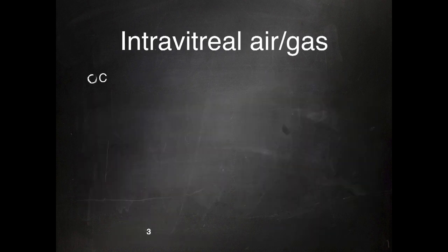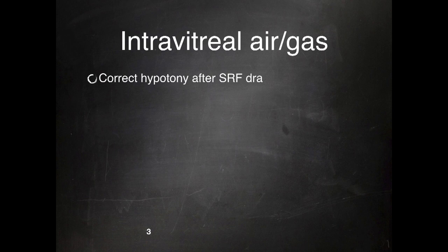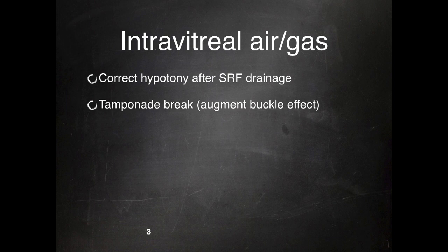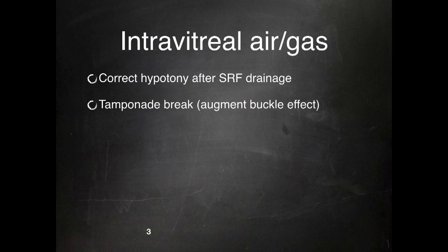It's important, if you're considering drainage, to have intravitreal air or gas ready to correct the hypotony after subretinal fluid drainage. The use of air or gas could also have a tamponade effect, augmenting the buckle effect.